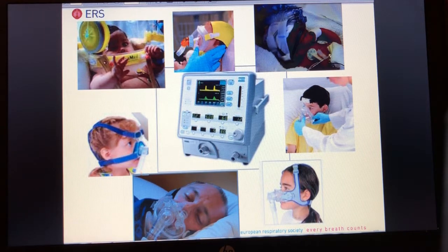By giving them PEEP or CPAP you can increase the work of breathing out unless you reduce the flow a little bit, and that's exactly what these contraptions do. It was the invention of these that allowed CPAP to really become successful in premature babies, because up until then the failure rate was actually very high.